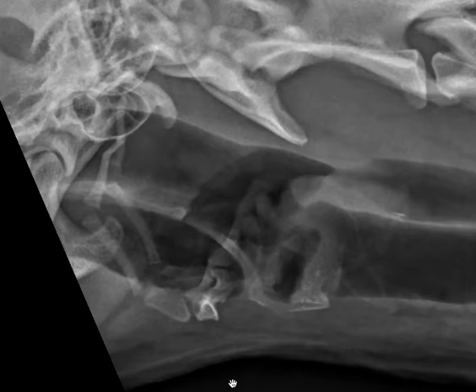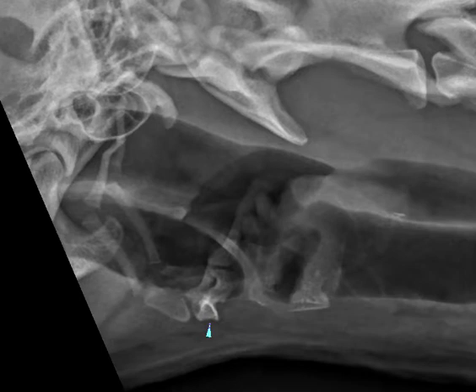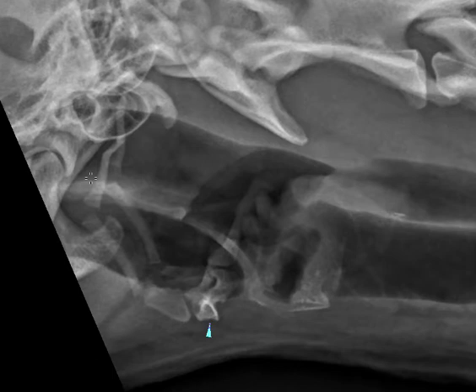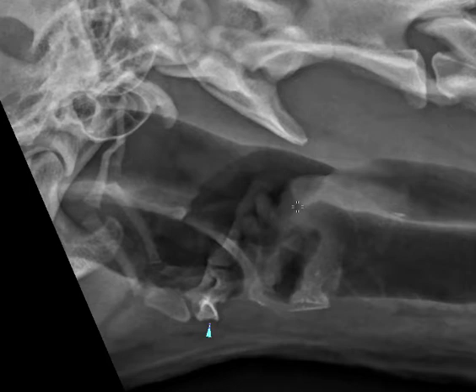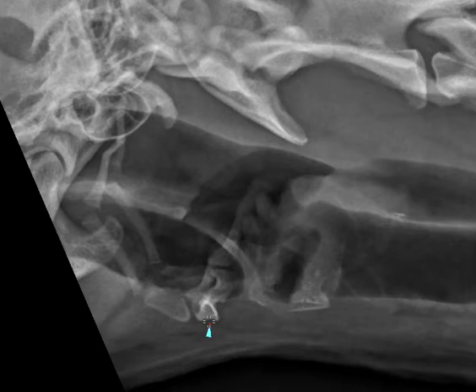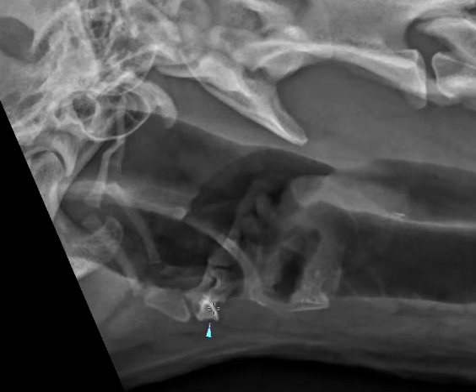Let's start with the most obvious thing that I usually find I can get regardless of the radiographic quality: I start by looking for the basahyoid. The basahyoid is the anchor of the hyoid apparatus. You'll recall that the hyoid apparatus is a series of bones that attach the larynx to the skull. The hyoid apparatus mostly is cranial to the basahyoid bone. We usually see it end-on, so it can have increased opacity compared to everything else because it's a summation or an end-on view.